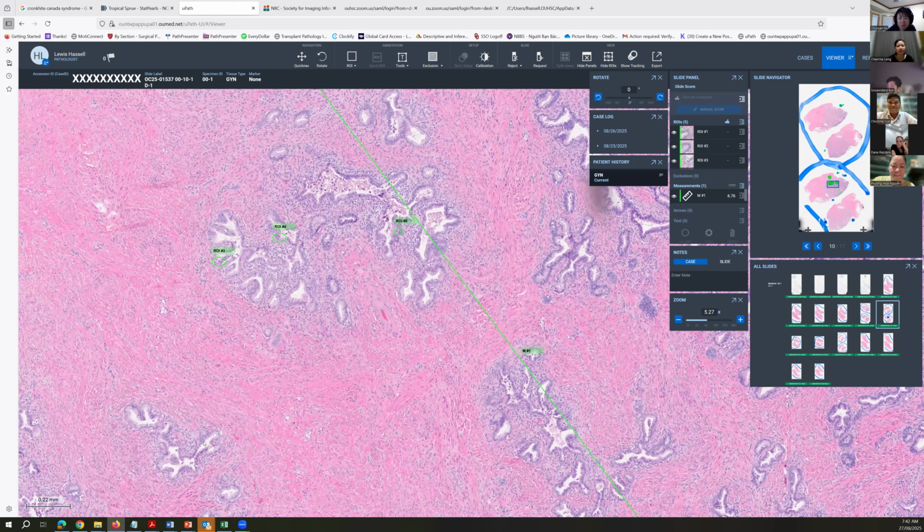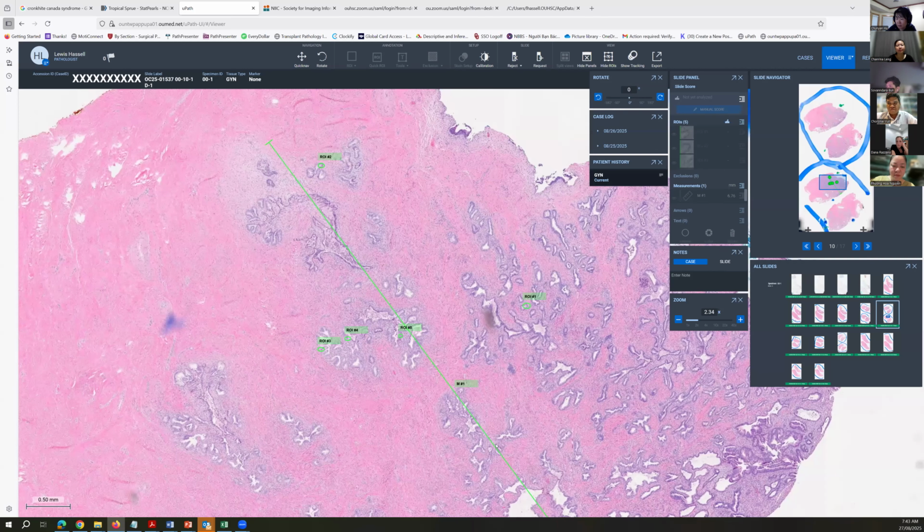No, I'd be scared, because the minimal deviation adenocarcinomas are always negative for P16, and other than the increase in mitotic figures and architectural atypia, I'd be a little bit worried. I wouldn't know. Yeah, it's a challenging case. So yeah, exactly the point.